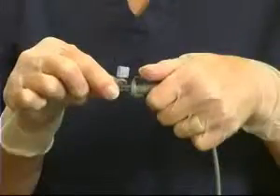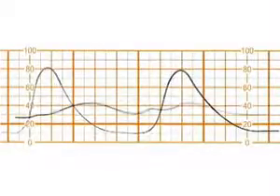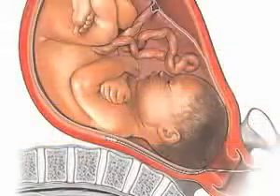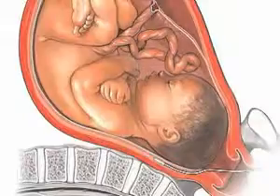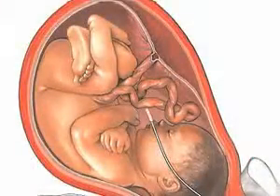If the catheter is placed properly in the amniotic space, long-term improvement in the waveforms should be observed. If the catheter is extraovular, a brief improvement in waveforms will be observed, but may gradually degrade and become dampened again. In the latter case, remove the catheter and reinsert it into the amniotic space, pausing to look for amniotic fluid flowing back through the clear catheter lumen.